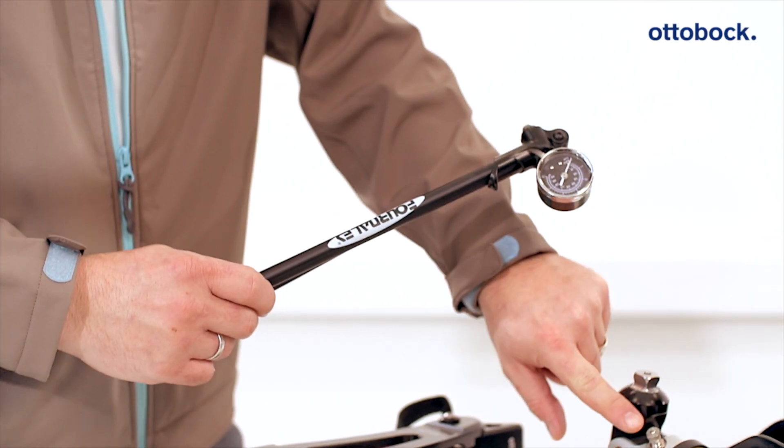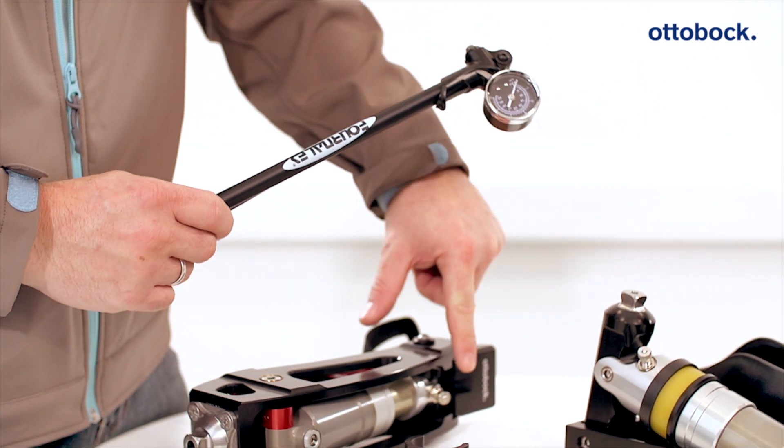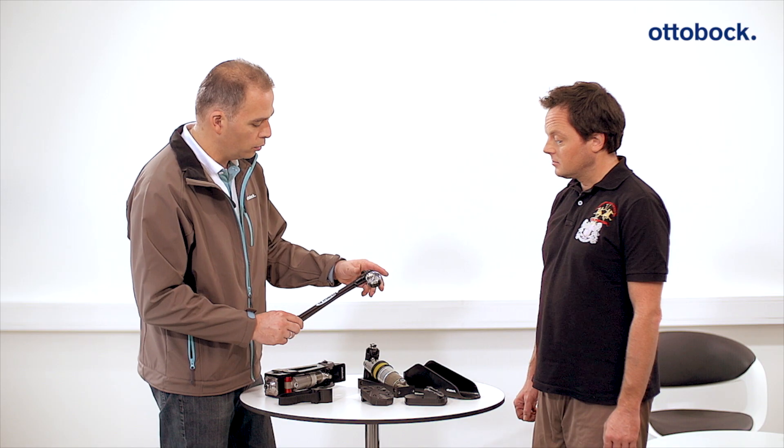The flexion resistance of the foot component and in the knee joint are adjusted with the help of the high-pressure air pump.